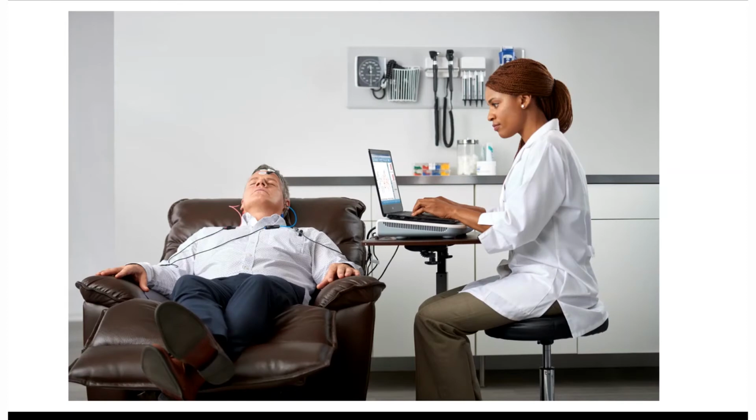Here's an example of the Audera Pro in action where the laptop is resting on top of the device and the cables are coming out the back of the Audera Pro connecting to the patient.